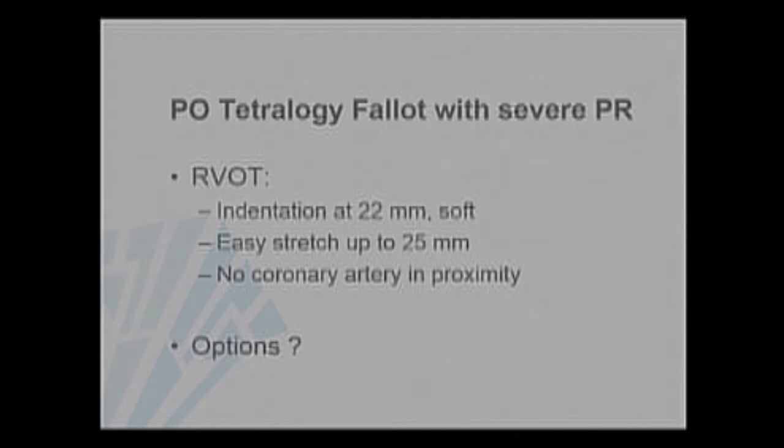The length of the stent, I'm not quite sure, I would have to see the measurements again, and then I would see where it ends, and if it ends, let's say, with a 24 millimeter internal diameter, you would have both options. You could take a Melody valve, or you could take a Sapien 26. Well, if I have a 24 millimeter landing zone, I think there's still an option for the Melody valve. But of course, the Edwards Sapien valve in this case would also be a good option.